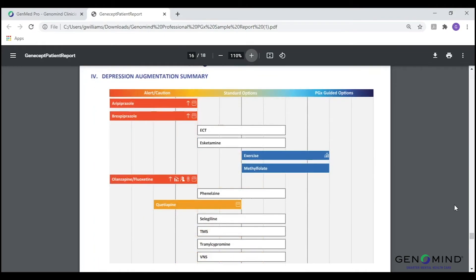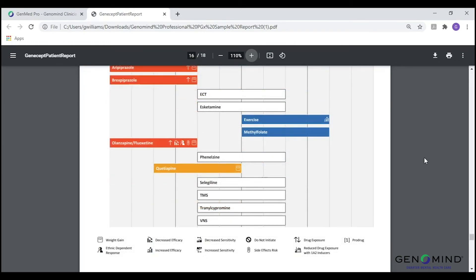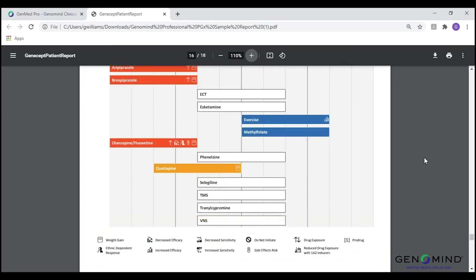Medications or therapies that are shifted to the right of the page indicate pharmacogenetic guided options. These are treatment modalities that may have an increased likelihood of effectiveness or tolerance based on the patient's genetics. These boxes will also appear blue on the graph. Additionally, you will notice several icons throughout the graph. The legend of these icons is found at the bottom of the page. These icons serve as a quick overview of specific gene-drug interactions and tell you why a drug was shifted on the graph.